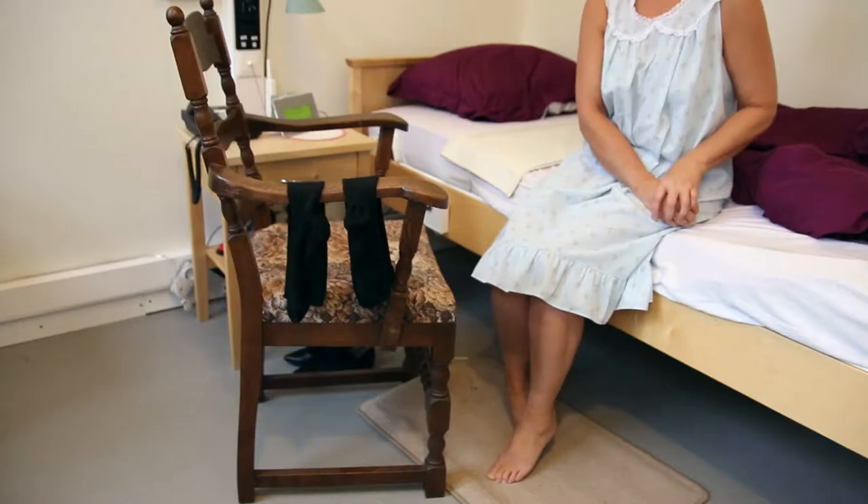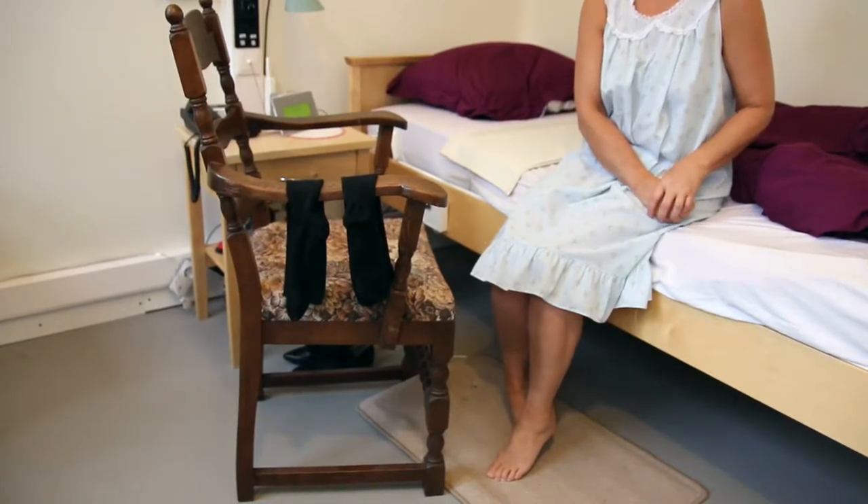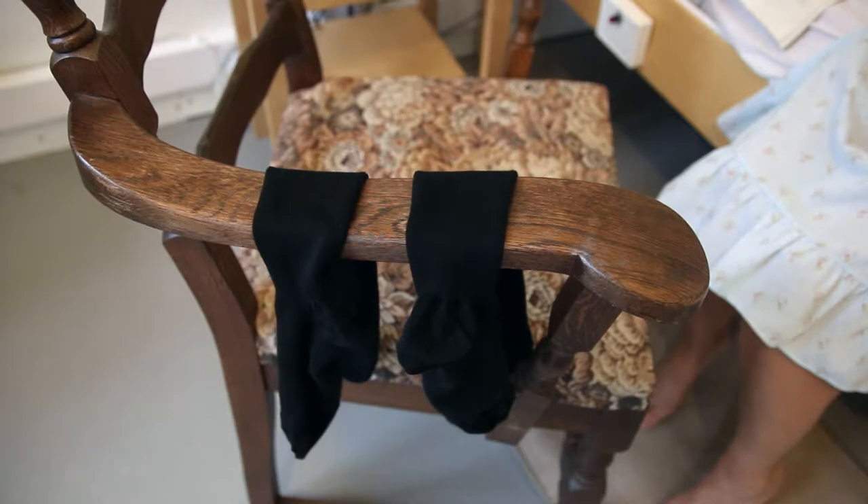Hi Nellie, this is me Susie. I hope you have slept well. As you can see, we have made this video to show you how to put on your support stockings. Here we are Nellie, in your bedroom. Here are your support stockings.